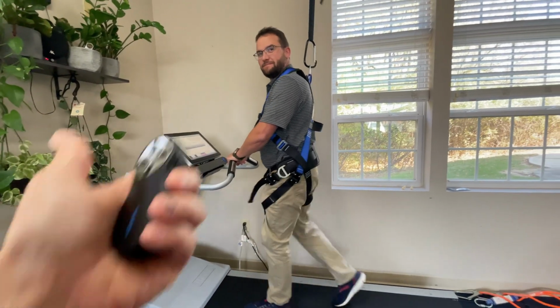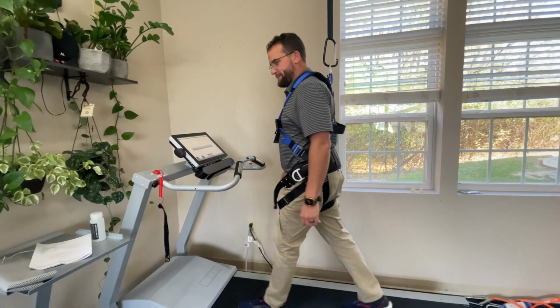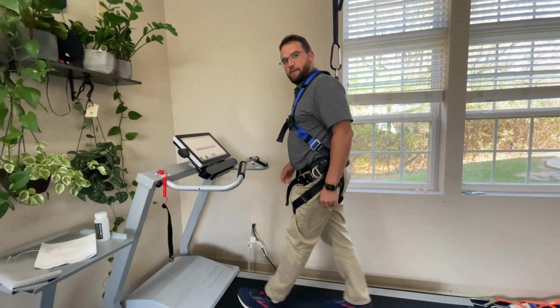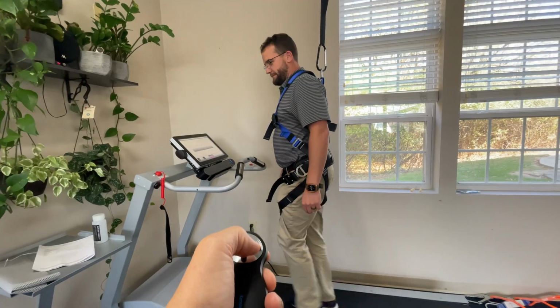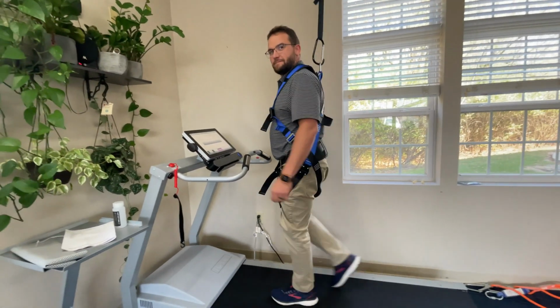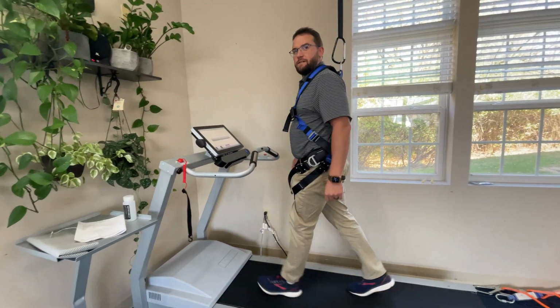Then I'm going to ask them to remove their hands from the handle. And I'll tell them again 1 or 2 times, I'm going to count down. So I'll do it. I'm going to count down 3, 2, 1. And then once they've gotten to the point where they've done it, they understand, they know what to expect, I'm not going to tell them anymore.